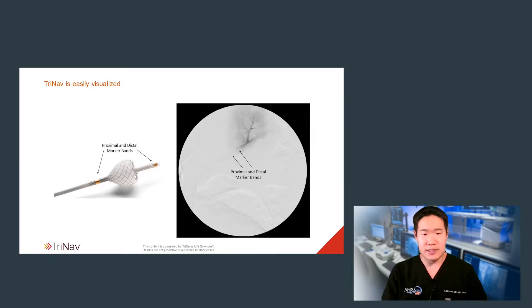When using TriNav, it's pretty simple — it acts like almost any other microcatheter. Just remember that the one-way microvalve, which is really the magic of the device — the smart valve — is located between the two easily visible marker bands. You can see them here on the actual image of the product itself, and also radiographically it's quite evident as well.